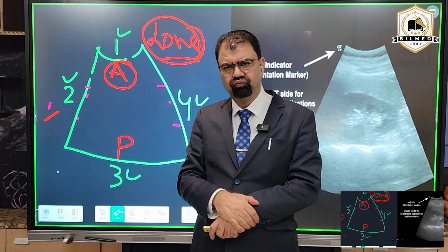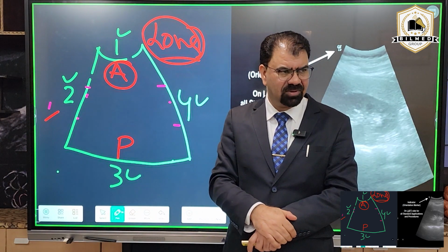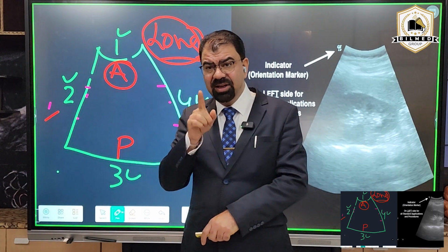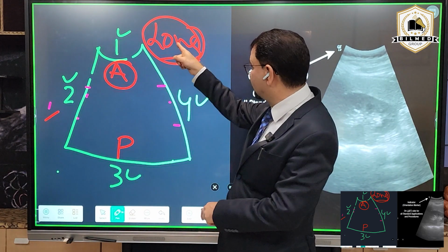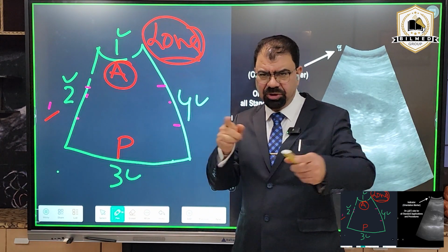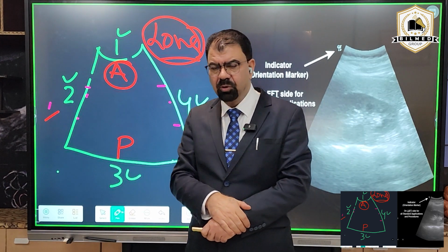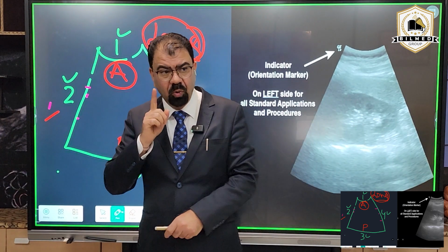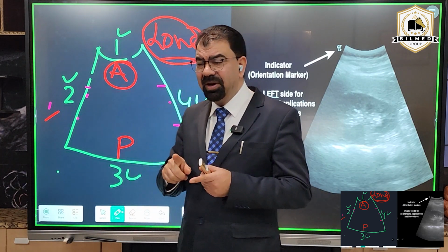Hurry up. You are having only 2 options, 2nd and 4th. And listen carefully. Where is the right? I am in longitudinal section. No, and no. I am repeating.